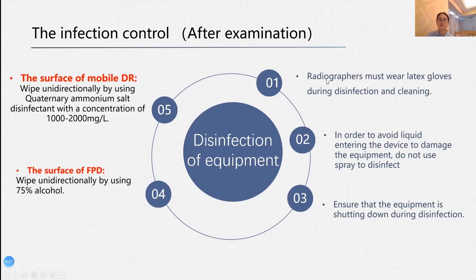And the radiographers must wear latex gloves during disinfection and cleaning. And in order to avoid liquid entering the device and damaging the equipment, please do not use spray to disinfect. And please ensure that the equipment is shut down during disinfection. I think this is a very important thing before we do the disinfection.